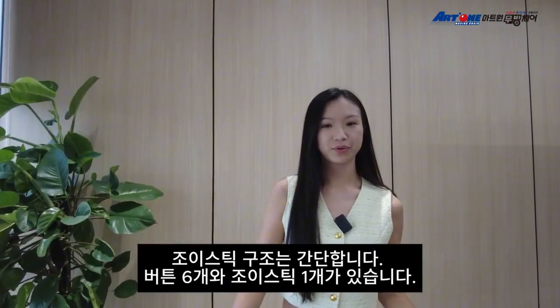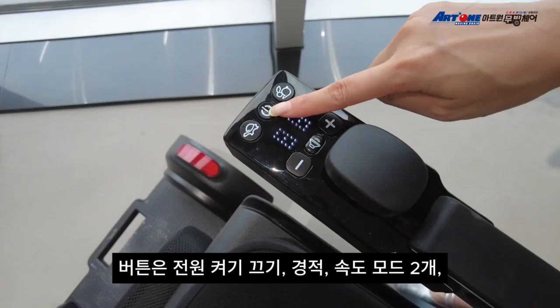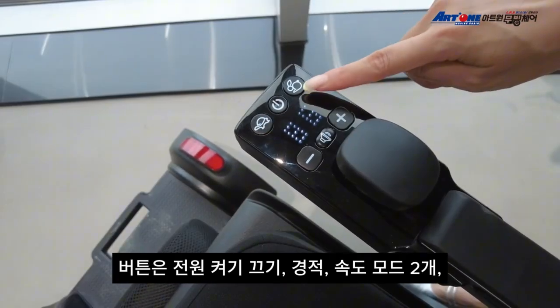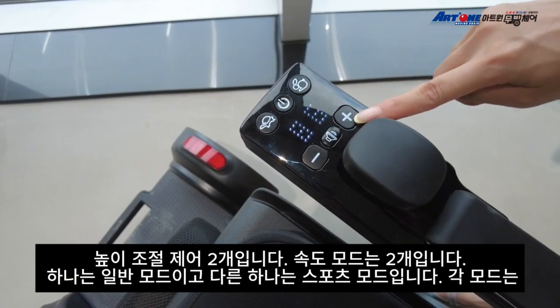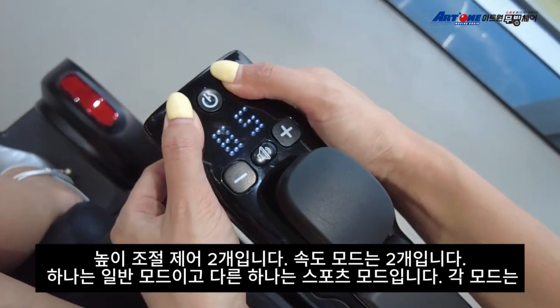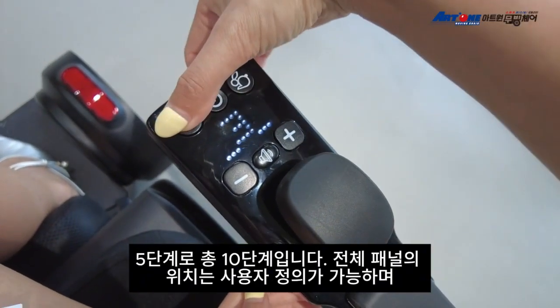The control panel is simple. There are six buttons and one joystick. The buttons include one for power on and off, one for the horn, two for speed modes, and two for controlling seat height and tilt angle. It has two speed modes: normal and sport mode. Each mode has 5 levels, so there are 10 levels in total.